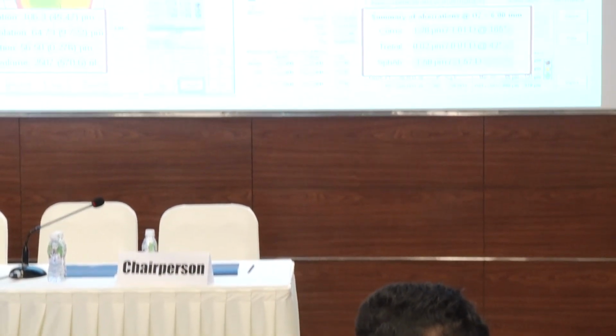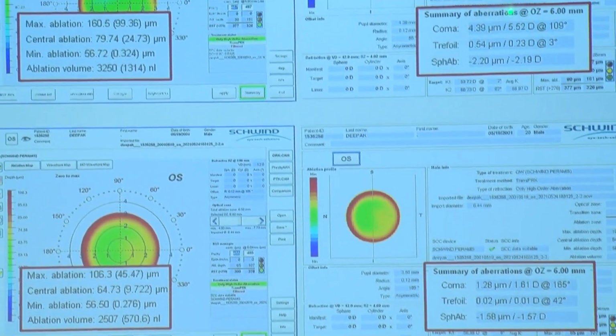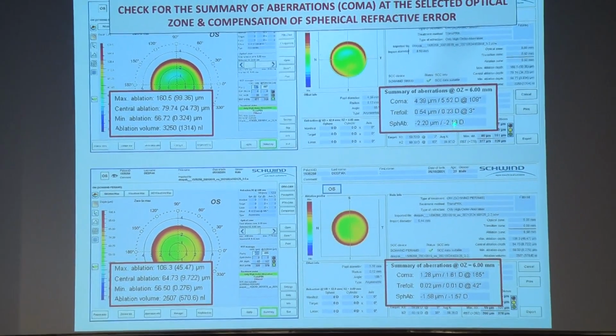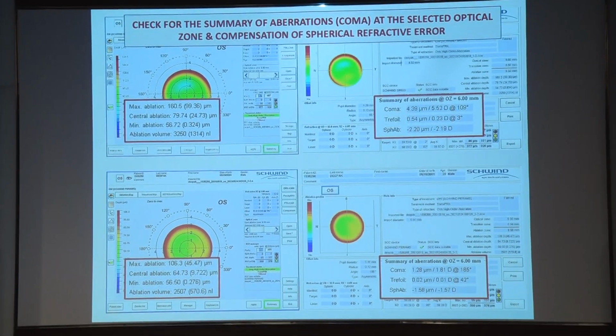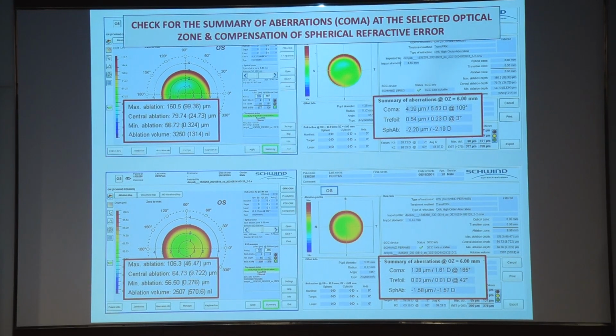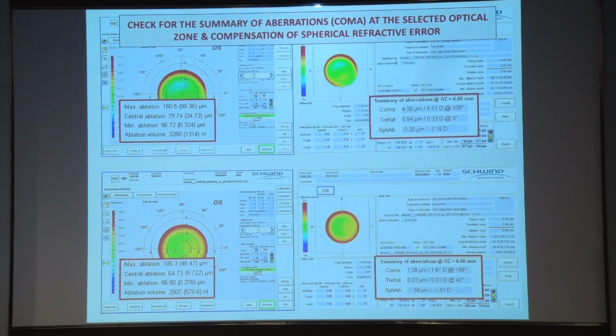And the question people always ask is, why should there be so much difference between a corneal wavefront and a total one? It's because of this factor here. This patient has 5 diopters of coma and 2 diopters of spherical aberration on the corneal surface, which is what your TCAT or Topo-Guided treatment of Alcon would address.